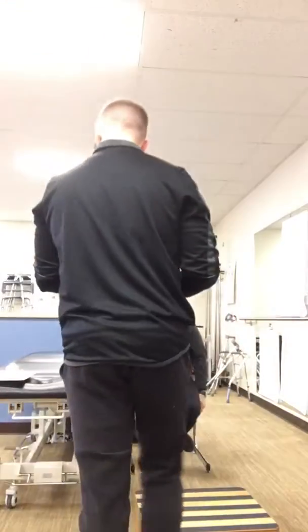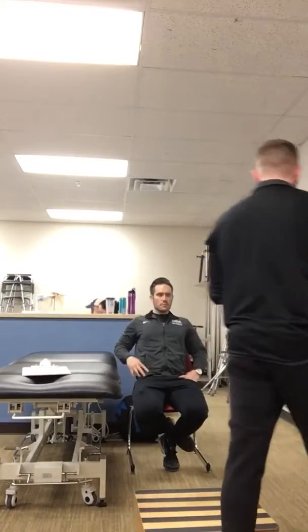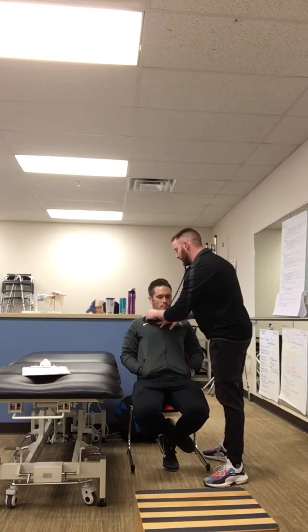Alrighty, so I'm going to be doing the pulmonary vital signs skill check. First, when you're going to auscultate the lungs, your pieces go forward. You've got 8 spots in the front, 8 spots in the back. So you're going to start at the patient's right.